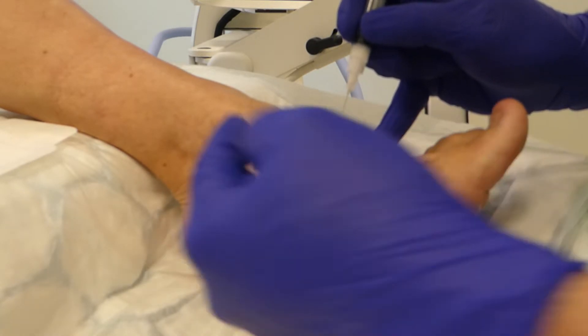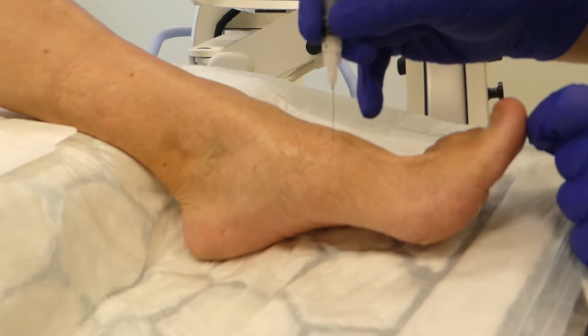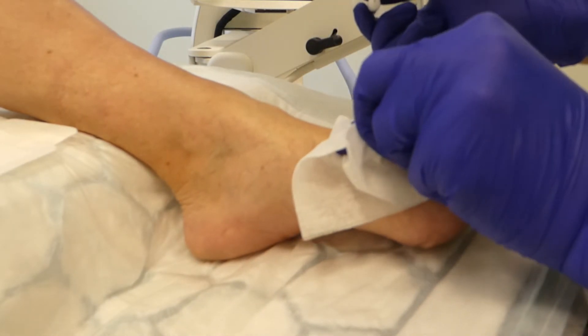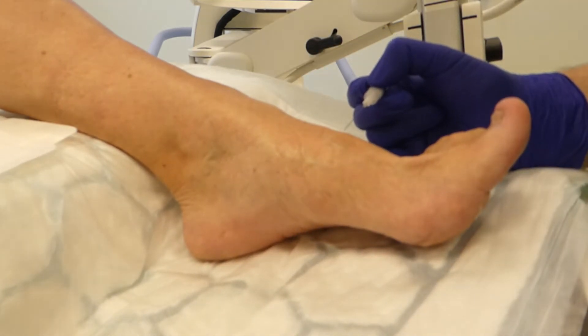With this joint, don't forget we've got tibialis anterior coming down medially, extensor hallucis longus coming down a little bit more laterally. So I'm medial to extensor hallucis longus. A little bit of pressure — see if there's any claret — no, that's fine. Second TMT here's our sore spot; little check X-ray.